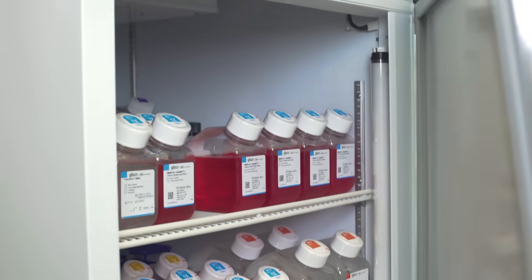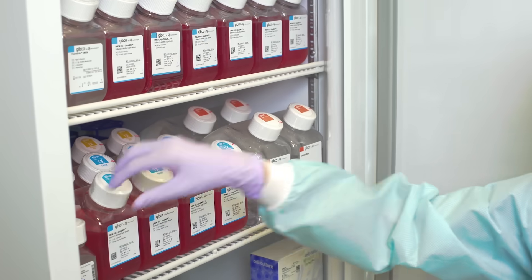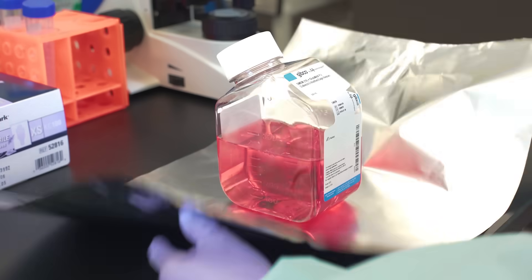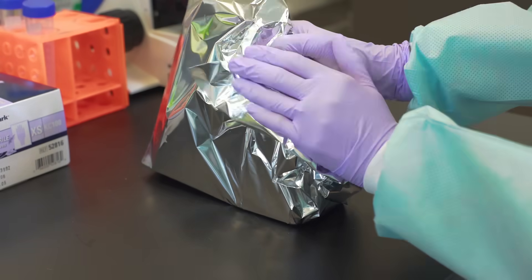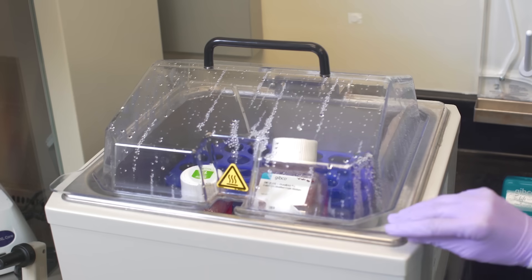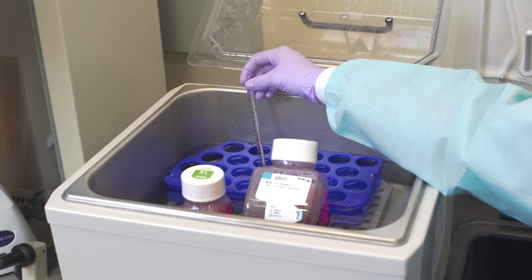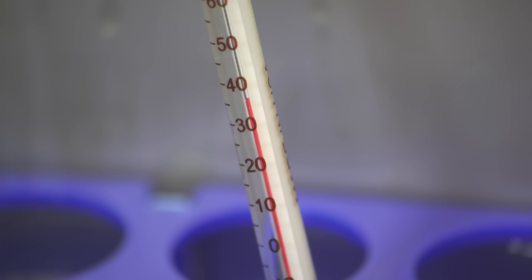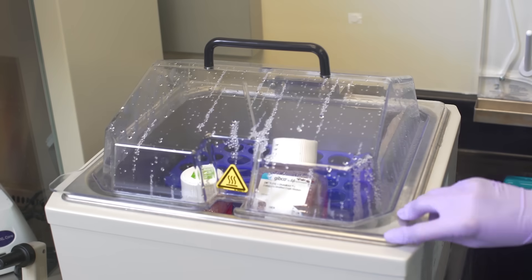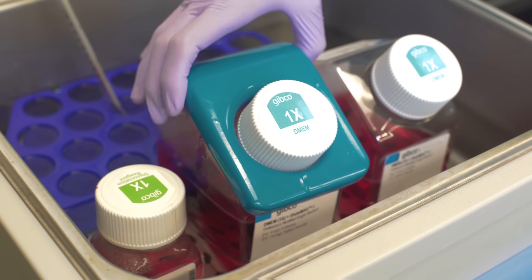Store all media and reagents according to the instructions on the label. Some components are known to degrade when left at room temperature or exposed to light for extended times. If the medium will be stored in a glass-front refrigerator or a cold room, wrap the bottles in tinfoil or store them inside a box. Some labs warm their reagents to 37 degrees Celsius before use. Warming reagents should take 10 to 20 minutes, depending upon the size of bottles you are using. Others choose to use reagents warmed to room temperature or directly from 4 degrees storage.